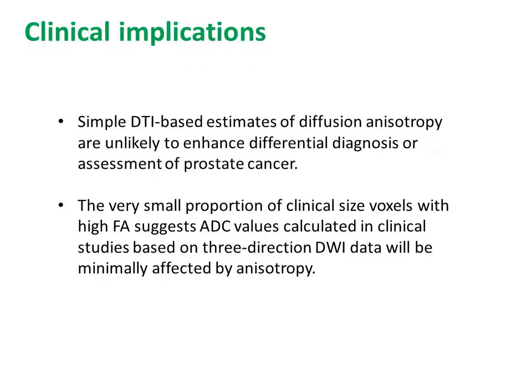And possibly of more relevance to current practice, where we're thinking about ADC measurements and DWI contrast, this study suggests that because the FA is so low in most clinical size voxels, the ADC calculation and the diffusion contrast is not going to be strongly dependent on the orientation of the 3-direction diffusion weightings that are typically applied in clinical measurements.